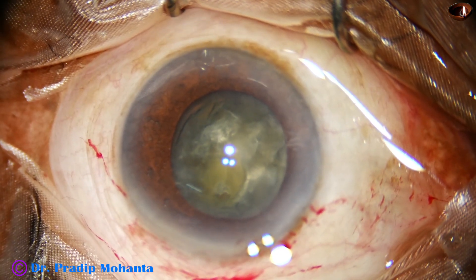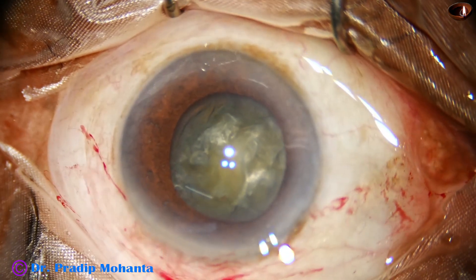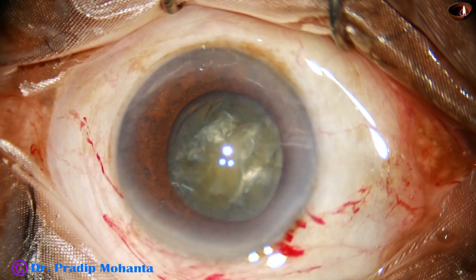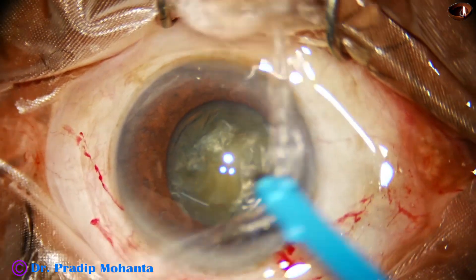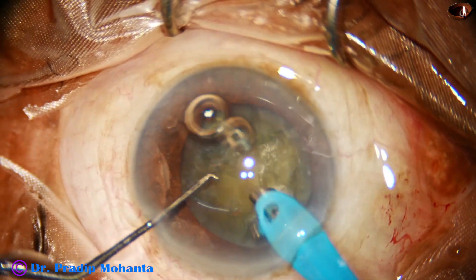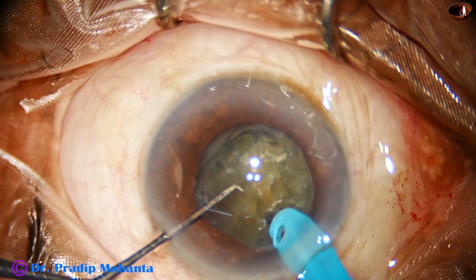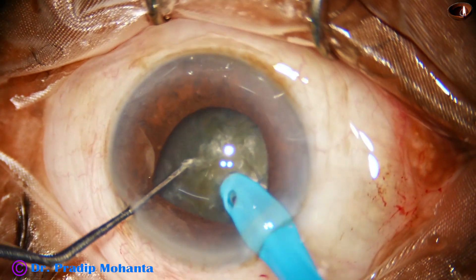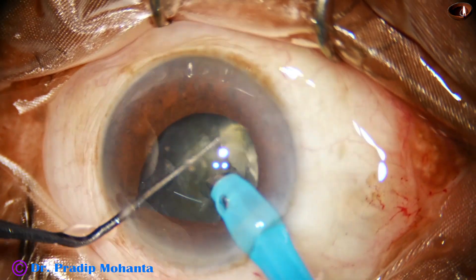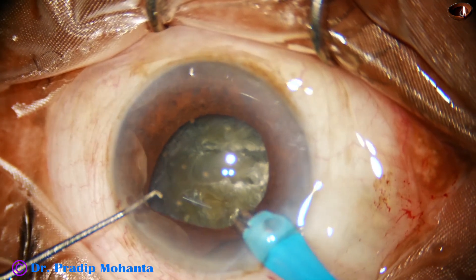Now, see very carefully what happens. The handpiece is taken, and the tip of the phaco needle is introduced into the anterior chamber. Some superficial lens matter is aspirated. And now, as I bury the tip of the phaco needle and try to have a good purchase on the nucleus, see what happens — the pupil becomes small. The iris tends to prolapse through the side port as well as through the main wound.